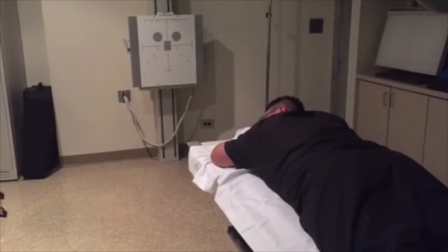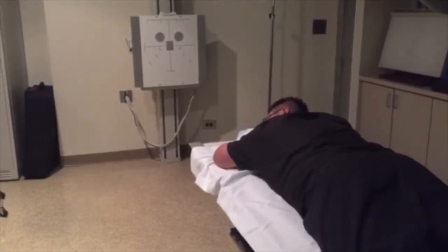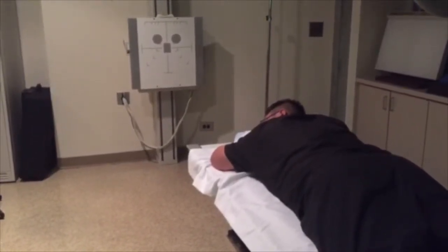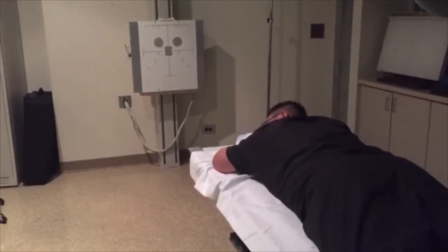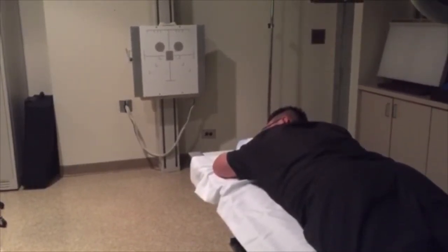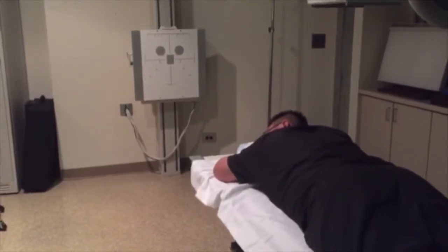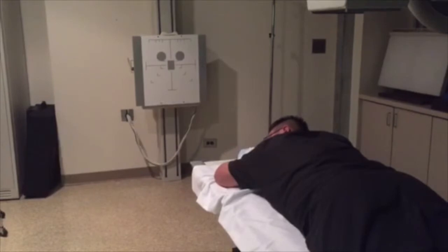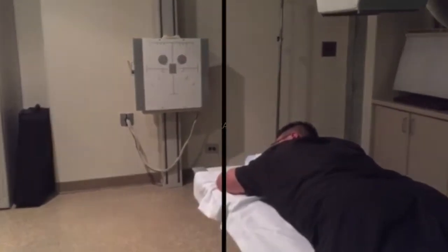In this video, we're going to demonstrate the images following the barium swallow exam. We're going to demonstrate the PAO oblique projection in the RAO position, AP projection, PA projection, and PA oblique projection of the stomach in RAO, and finally the lateral projection.